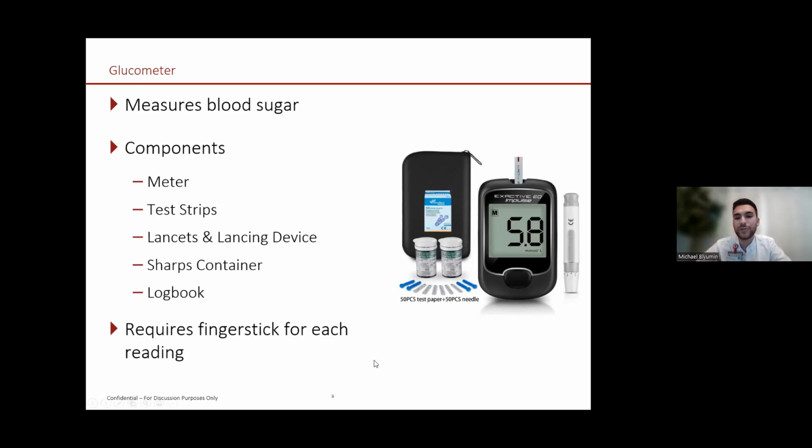And then, of course, this kind of measuring requires a finger stick to get each reading. It may not be the most pleasant experience, but typically it shouldn't be too painful. And if it is, we're going to talk about another device where a finger stick is not needed regularly.